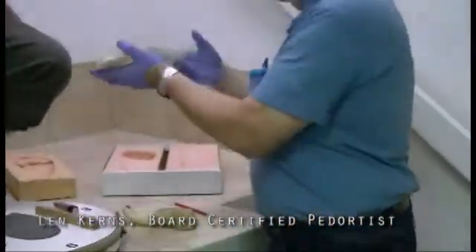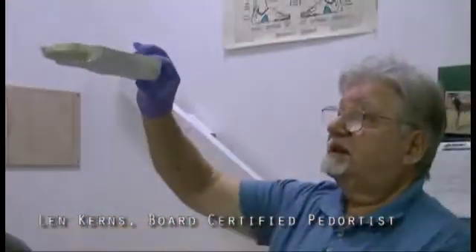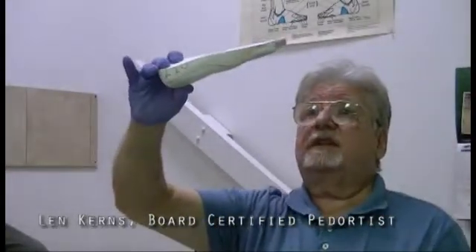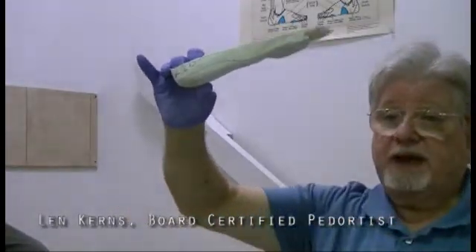And here's a cast just to show you. You see how thick the heel is on the lateral side? This one came in just like that with the toes up in the air. And of course I can't make a proper orthotic like this, so I had to ask the doctor to recast.